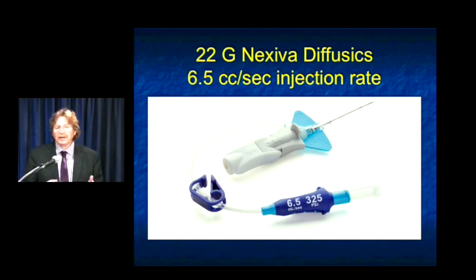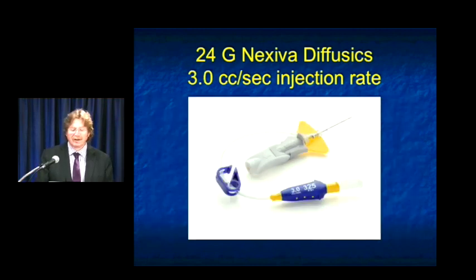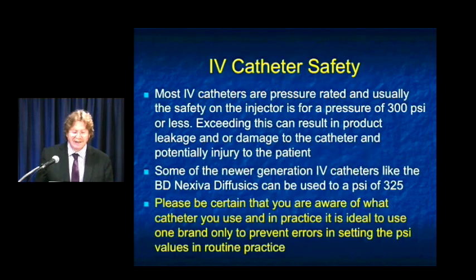The cost is minimally more expensive, but if you think about it in the big picture, between sticking once, the speed of putting the needle in, and not messing around, and that takes nurses' time or IV people's time, it's really very, very cost effective. And in fact, we're writing an article about that. So it's very important to have the right catheters. So that indeed becomes very, very important.